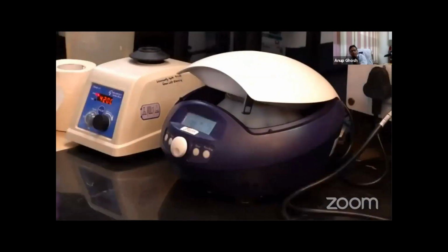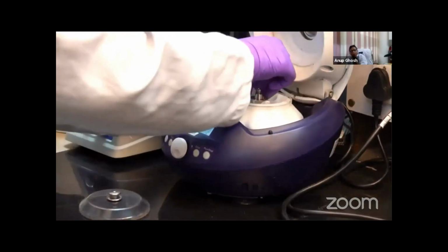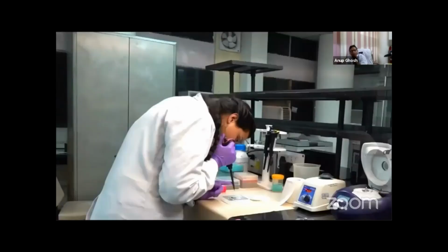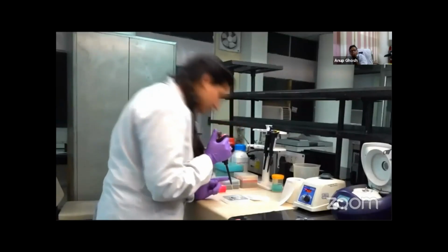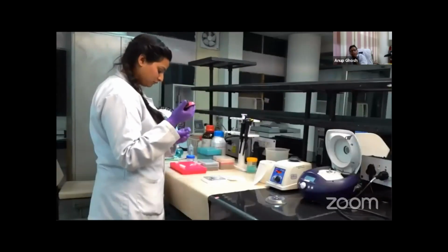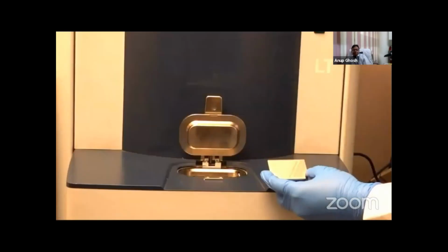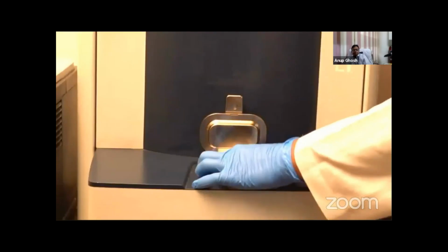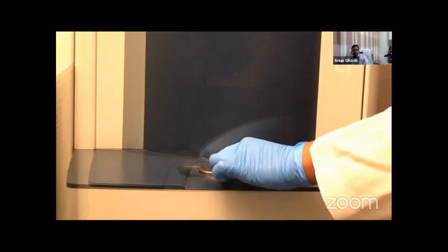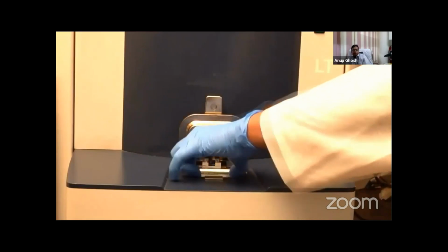After vortexing, the lysed suspension is centrifuged. Now, after centrifugation, 1 microliter of the clear supernatant is taken and spotted onto the MALDI plate. After drying this spot, 1 microliter of matrix is added on top of this dried spot. Now your MALDI plate is ready. Gently place your MALDI plate into the MALDI Biotyper machine as we are showing here. We will also show you here how the plate can be removed from the load port. Grip the plate from both sides and remove gently.